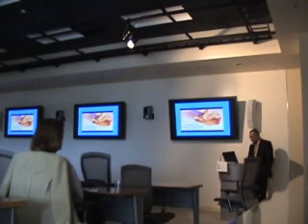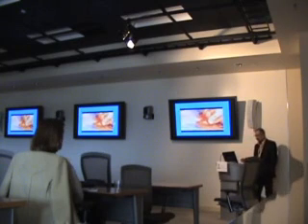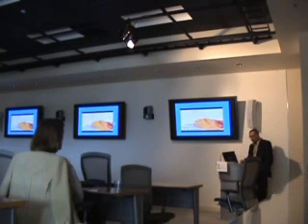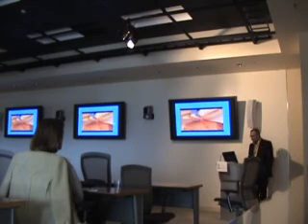Also, not only for surgery, when using the whole cadaver, we can use this model to practice central line and arterial line applications. Here practicing subclavian catheter.